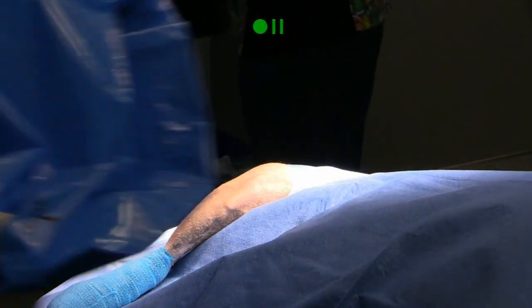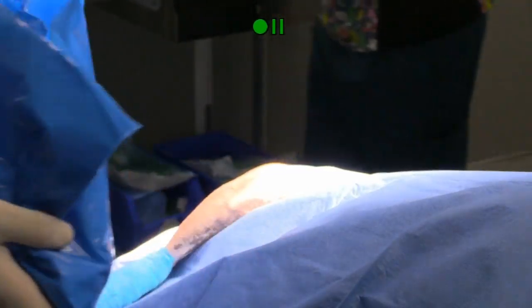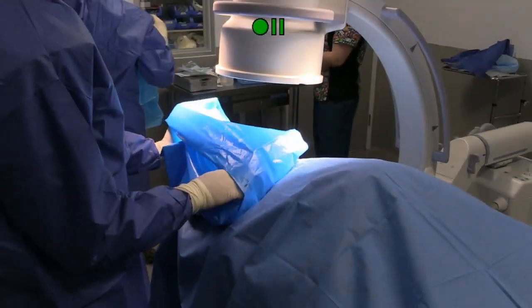So we're going to put a Mayo stand cover on top of the C-arm now to just provide some protection there.